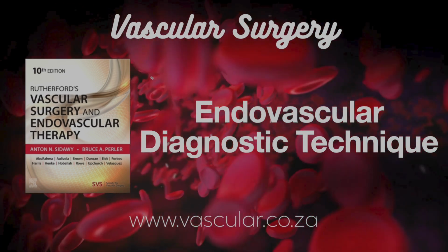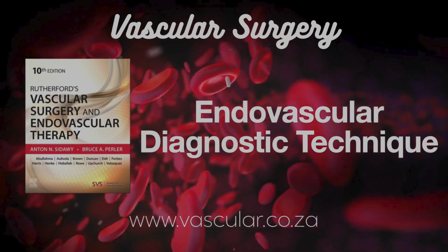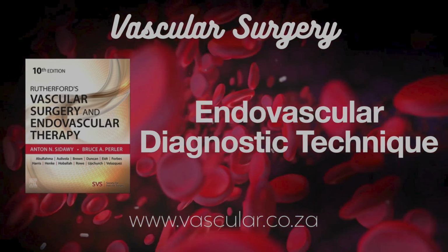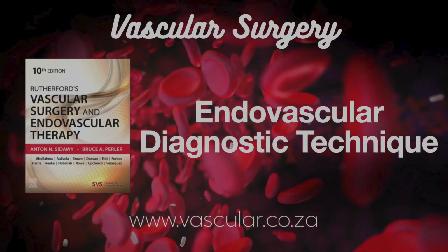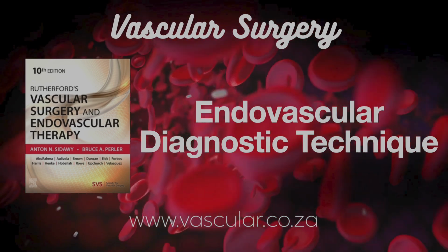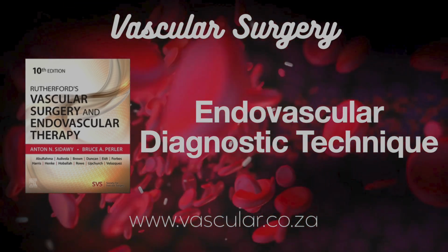When would you need longer ones? Maybe a 45-centimeter sheath to work on the opposite leg from your access point, going up and over, or a 90-centimeter one to reach the aortic arch from the groin, or mesenteric vessels from the arm. Need that stable support. So the rule is? Use the shortest sheath that does the job adequately. Minimizes sheath-related issues.